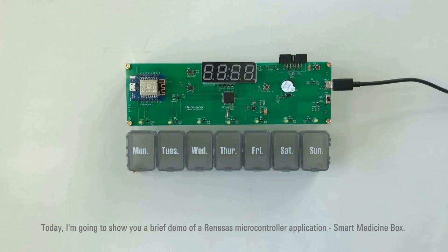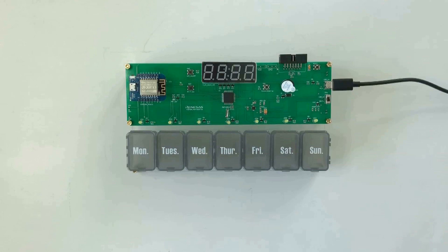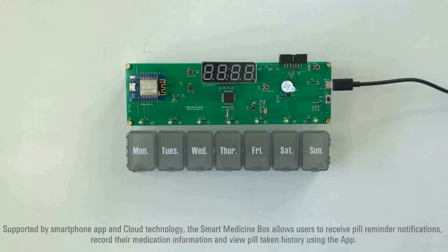Today, I'm going to show you a brief demo of a Renesas microcontroller application: Smart Medicine Box. It is a smart weekly pill box designed to help users store, set up reminders, and record pill-taking events for their pills. Supported by a smartphone app and cloud technology, the Smart Medicine Box allows users to receive pill reminder notifications, record their medication information, and view pill-taking history using the app.